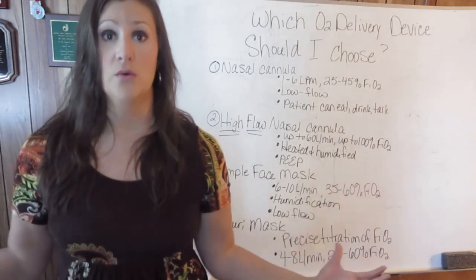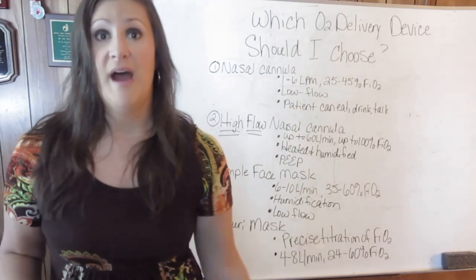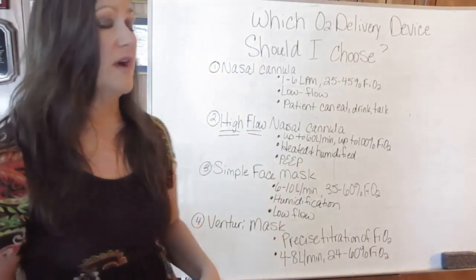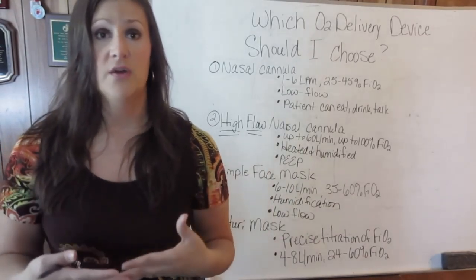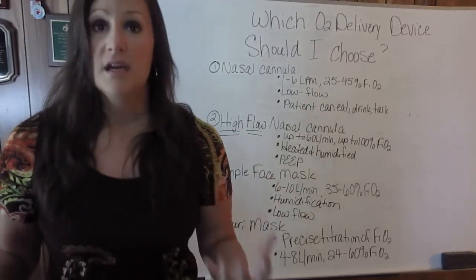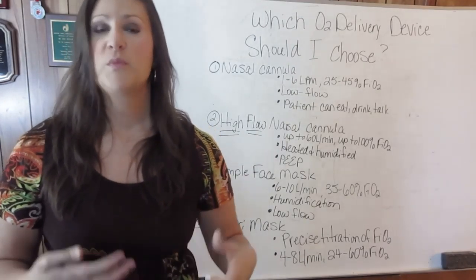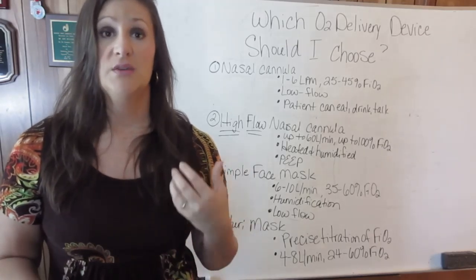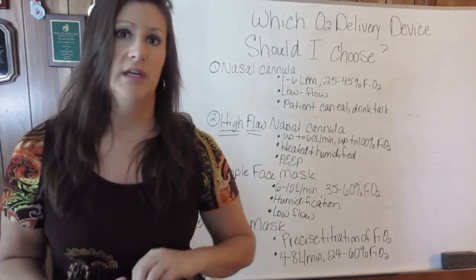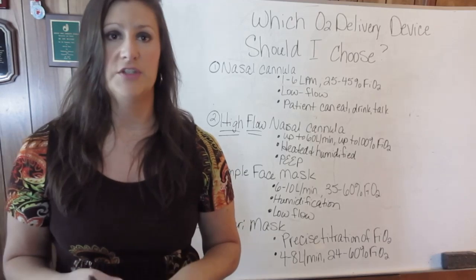Now keep in mind that all of these devices here require that your patient be able to breathe in and out on their own. We're not talking about people that need to have BiPAP or mechanical ventilation. All these are devices that simply deliver FiO2. Now the high flow nasal cannula does help some with ventilation, with CO2 removal, but in someone who is severely acidotic, we're going to have to start looking into BiPAP or even mechanical ventilation.